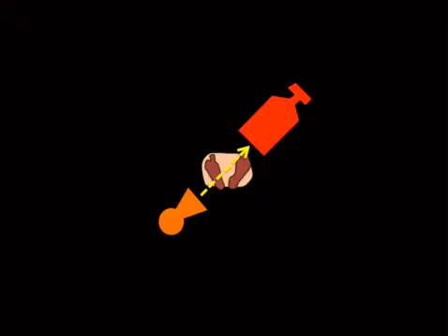So where's the best place to stand? Like, where should I stand in the room? You're going to make this decision assuming that all things are equal for performing the procedure, to minimize your Compton scatter. So where you want to stand is on the side of the image receptor. That way you're avoiding the majority of the scatter. So standing over here is the best spot to stand.